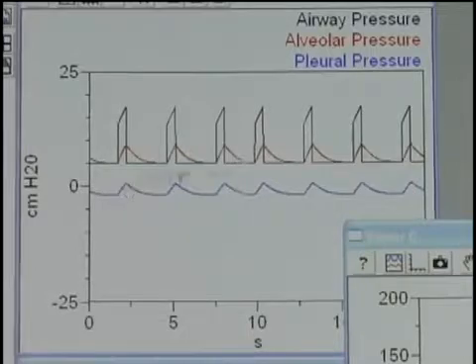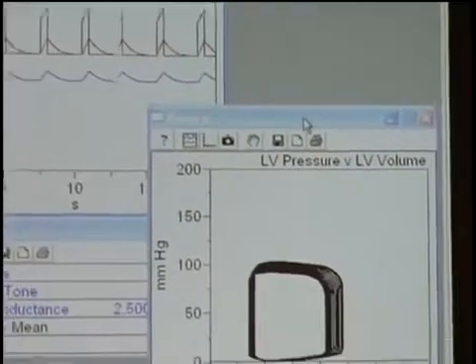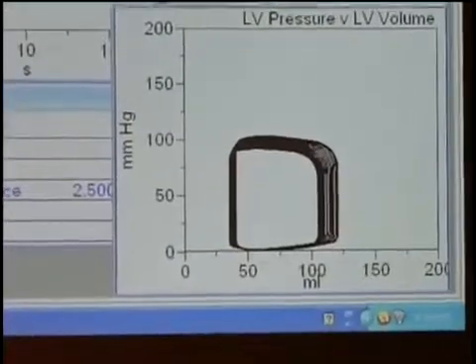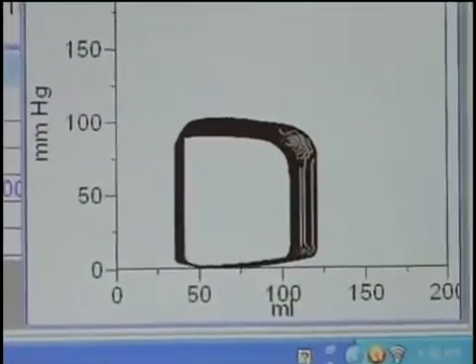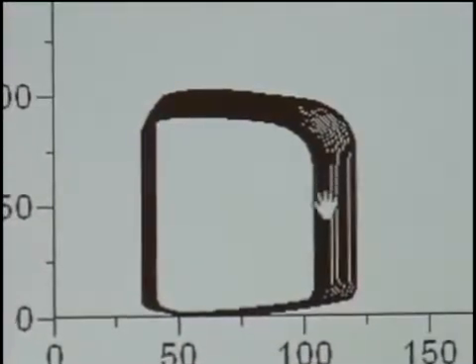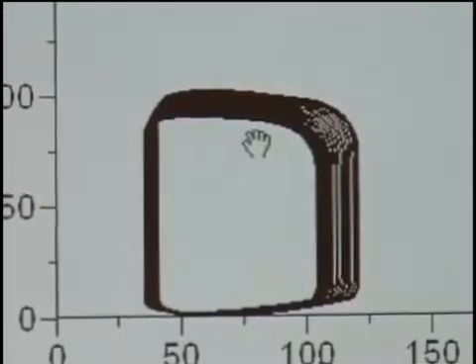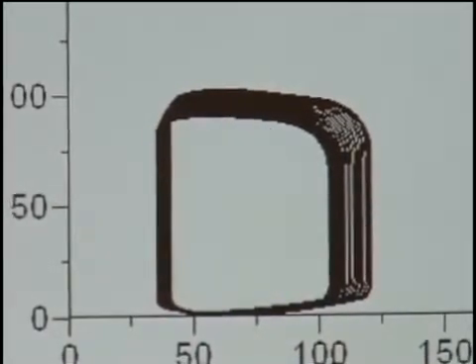Back to interconnectedness, you predicted what was going to happen to the heart, right? If we fill up the lungs more than they're usually filled, it's going to squeeze the heart. The heart's going to get smaller, isn't it? And you saw it happen. The left ventricular end diastolic volume fell, and the blood pressure fell. The heart and lungs affect each other in ways which are inextricably tied to each other, and ways which in the real life of medicine are important.